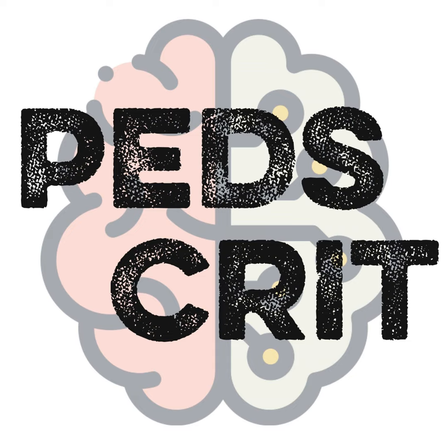One of them is that in general, because these patients need to be anticoagulated, especially little patients, the smaller they are, the more important that's going to probably be, you need to be really careful about things that we would normally not think about. Placing a peripheral IV or an NG tube can be lethal, right? Because they can bleed out. Now, I always say on an ECMO patient, it's better for them to bleed in a place where they can actually let the blood out than it is to bleed into an enclosed space.